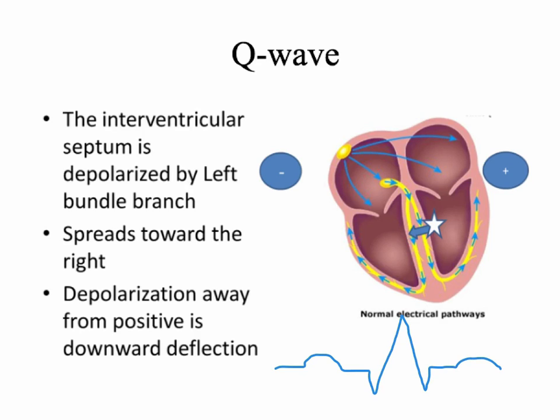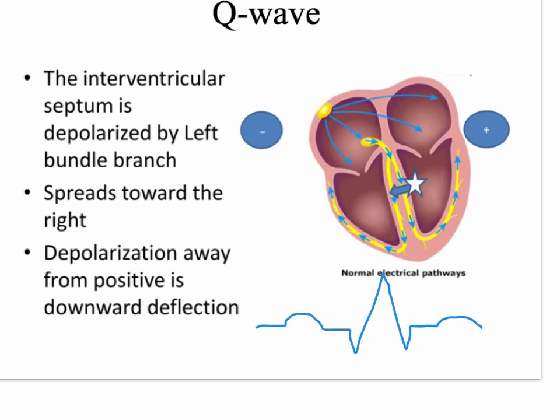So what causes the initial Q wave? Usually, and I want to remind you that usually if the wave is subjectively small, it's referred to in lowercase letters, and if it's subjectively large, it's referred to in uppercase letters. Depending on what lead you're looking at, and depending on the cardiac abnormalities you might see, the R wave may be subjectively small, and you would put the R wave as lowercase. But that's just a convention that you're going to see if you look in the textbooks. For the most part, I'm going to refer to all of them in capital letters.